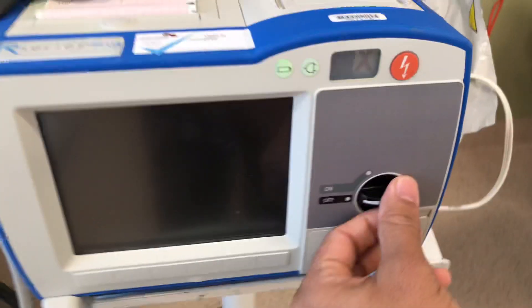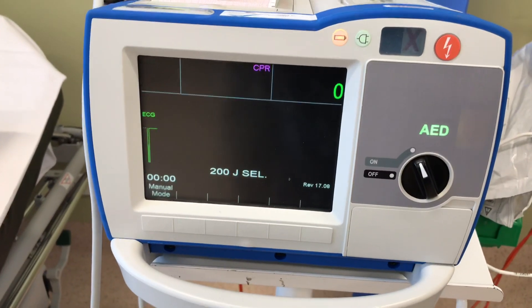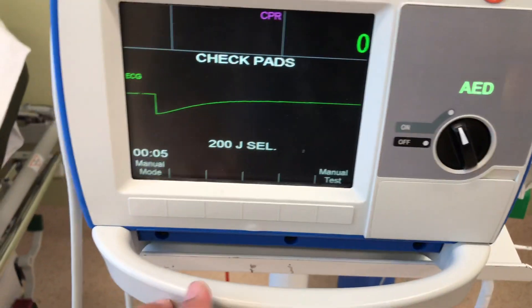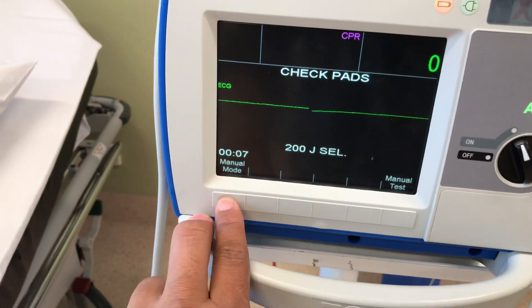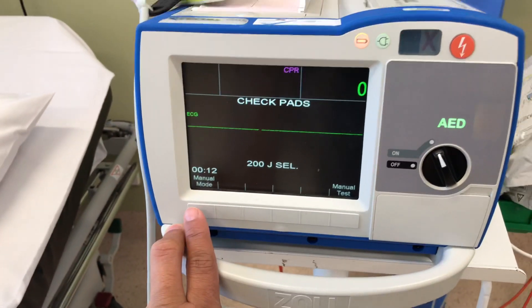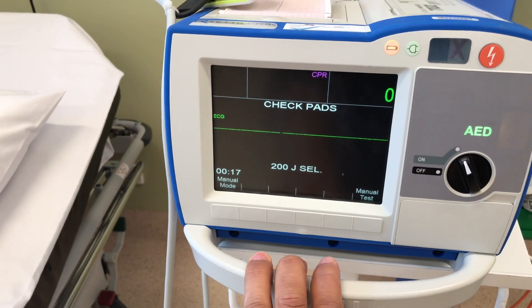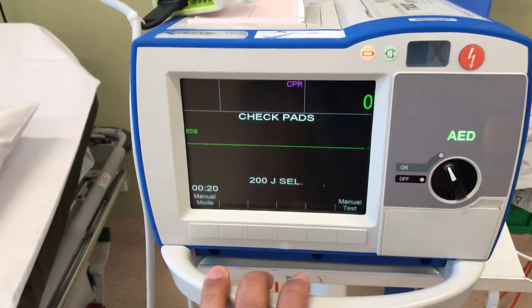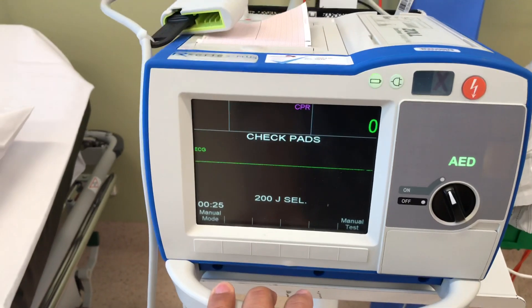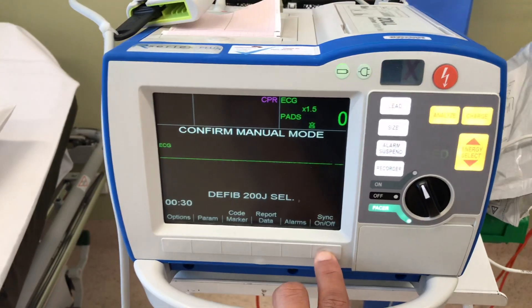Now what we do is we just turn the device on, which will take you to AED mode. Now I'm selecting manual mode to do the testing. When in AED mode, it just works as a normal AED. So as an ALS nurse, if you want to change the joules — the electricity — you have to select manual mode. And also for testing, you have to select manual mode. So I'm clicking manual mode here and clicking to confirm.